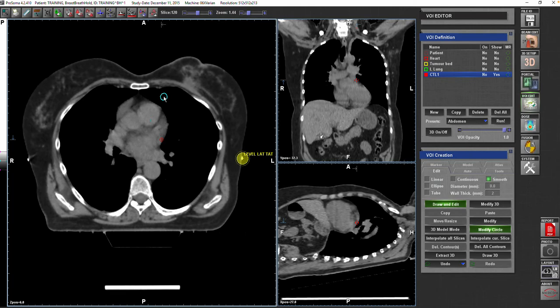There are a lot of videos on YouTube where you can see the branches, how to look at it and where to find it. So I would recommend that you look at the subclavian artery and know exactly how many branches it has. The internal mammary artery is coming from the subclavian artery. The internal mammary vein will end in the innominate.